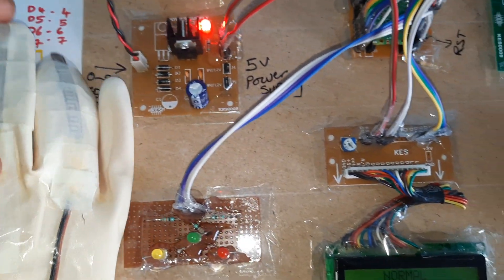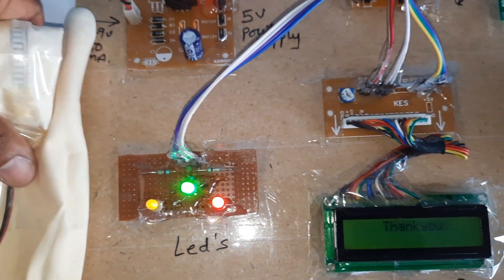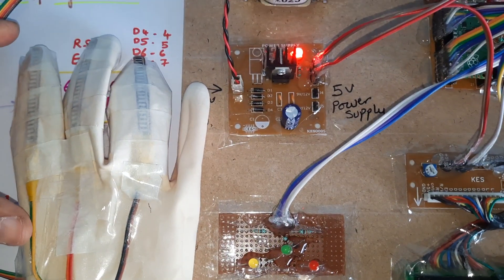Further gesture demonstrations: bending fingers triggers 'put,' and another gesture outputs 'thank you.'